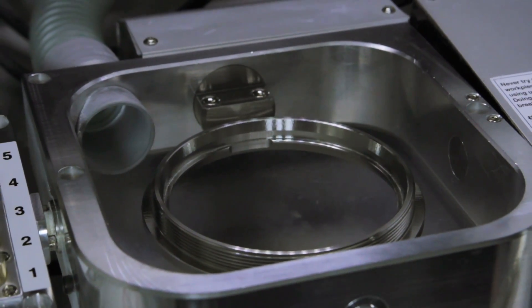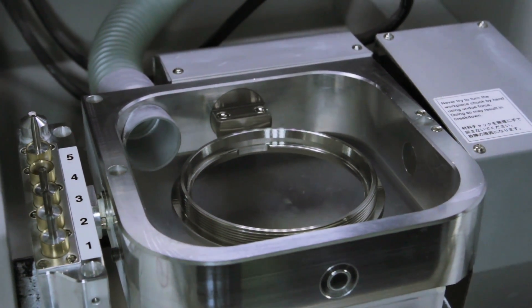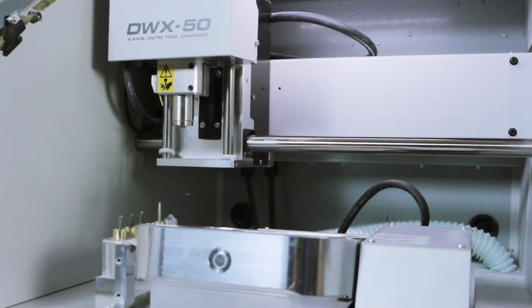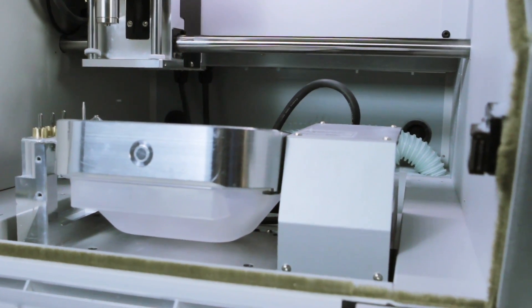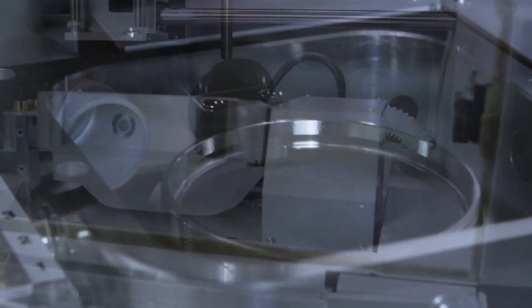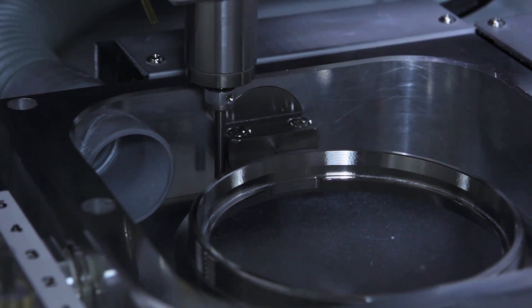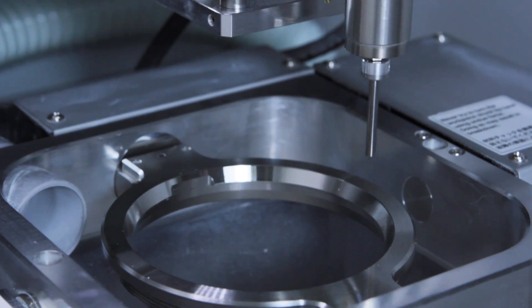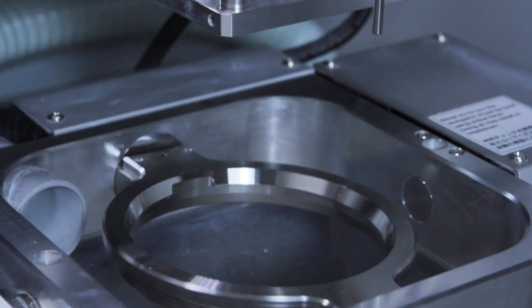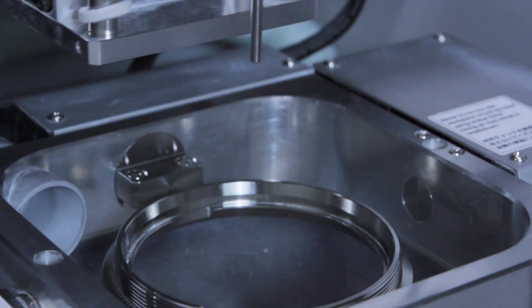The area where your mill is placed and how aggressively your milling strategy is will affect how often the periodic correction calibration should be performed. If your DWX50 is not in a temperature-controlled environment, you may need to calibrate more often. Temperature changes between hot and cold can affect the accuracy when milling. An aggressive strategy can cause the mill to require calibration more often as well. Calibration should be done according to each user's needs.